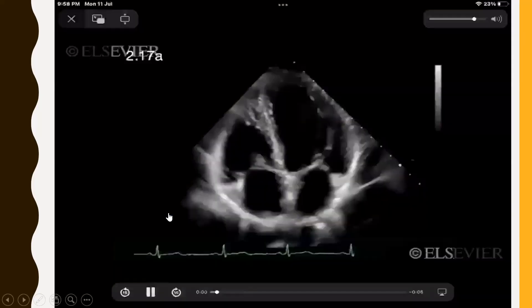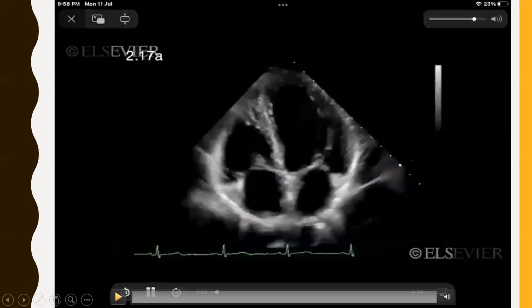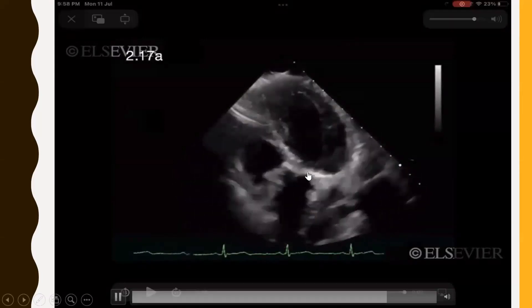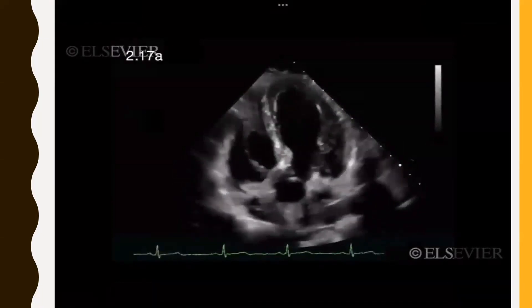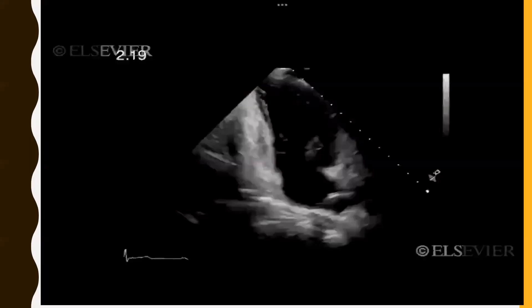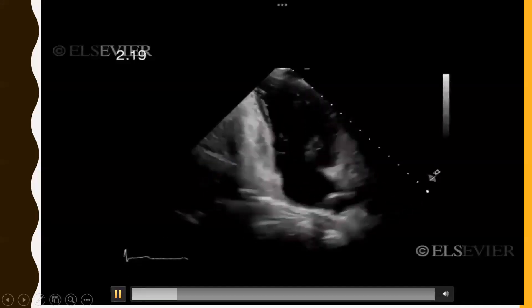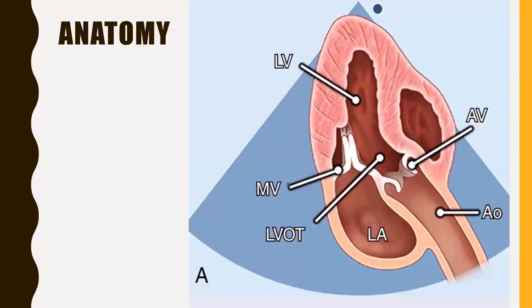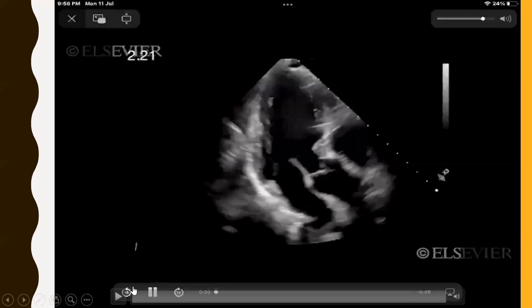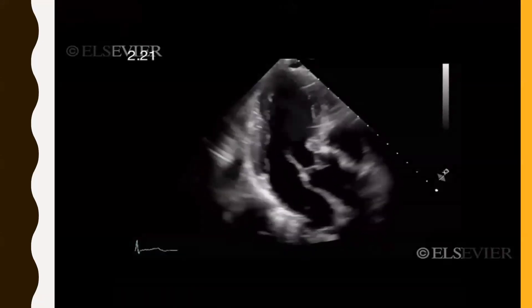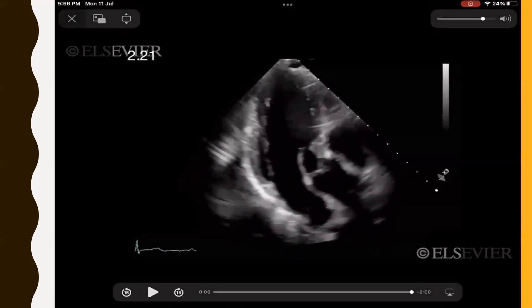The apical five-chamber view shows LA, LV, RA, RV, and the aorta with the aortic valve. The apical two-chamber view shows LA, LV, and focuses on the mitral valve. The apical three-chamber view shows LA, LV, the mitral valve, and the aortic valve, with pulmonary veins opening into the LA also visible.